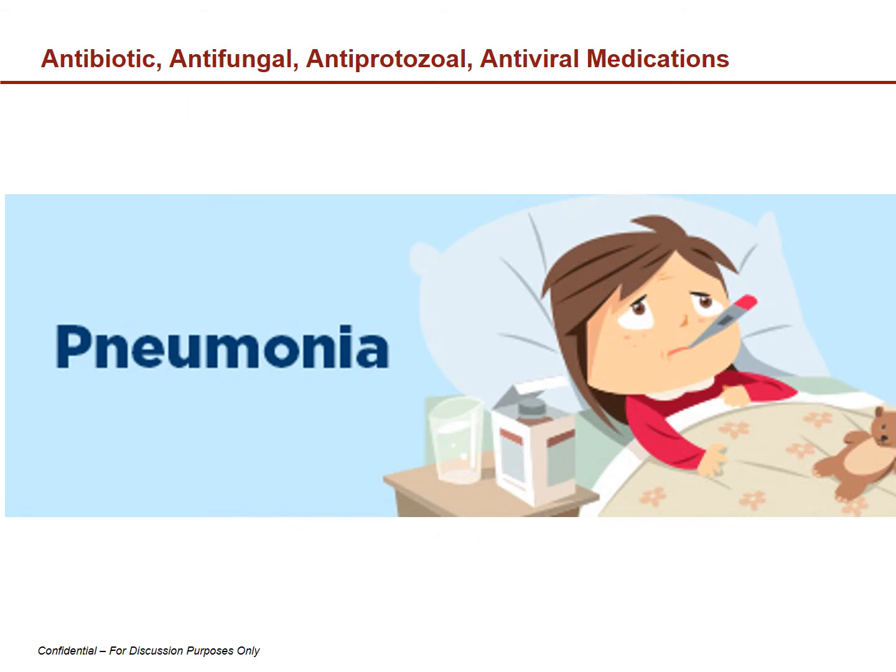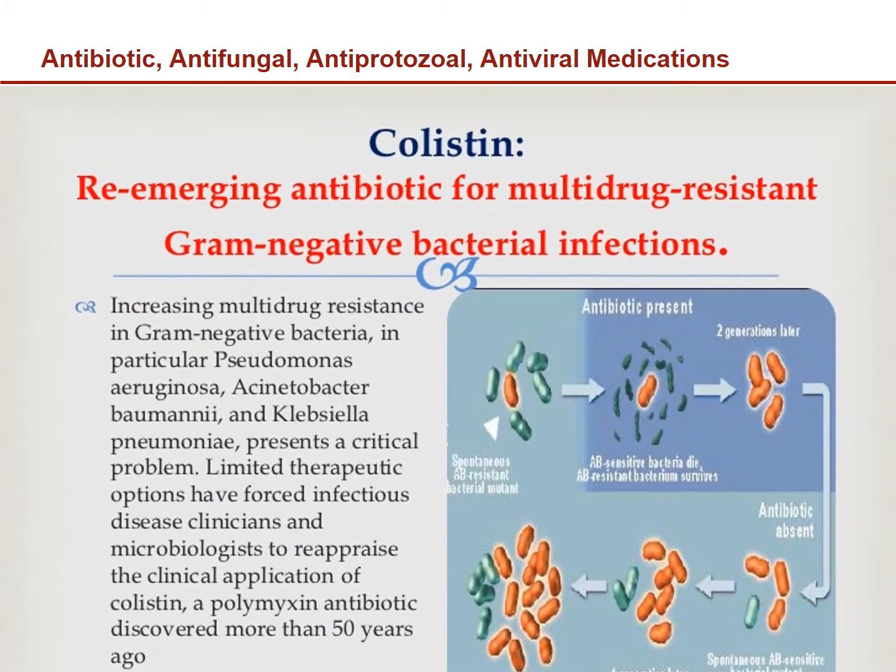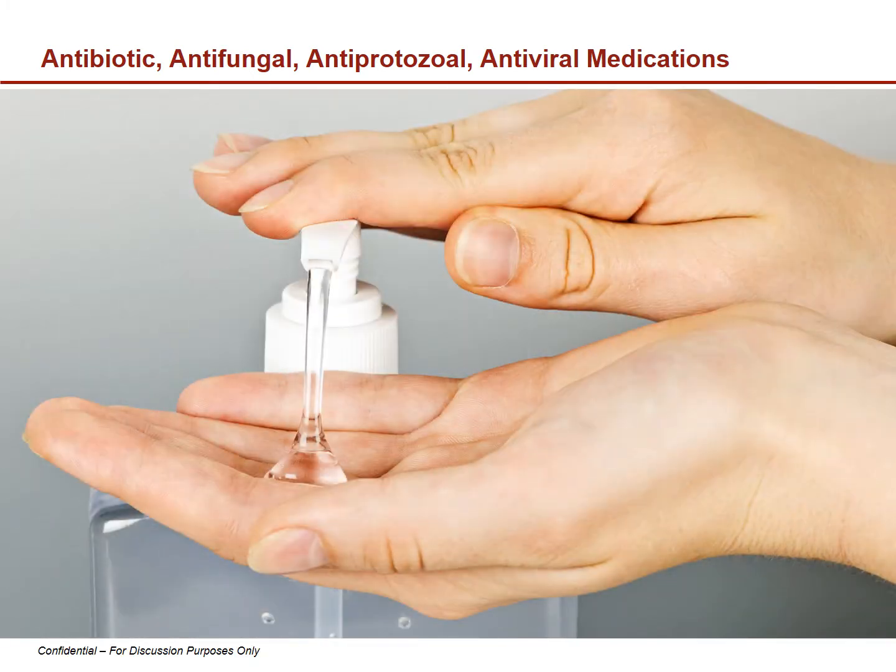Colistin is an antibiotic that can be nebulized to treat hospital and ventilator-acquired pneumonia, especially those caused by multi-drug resistant gram-negative bacteria that has not responded to treatment with systemic antibiotics. Nebulized colistin may also be used to treat infection with Pseudomonas aeruginosa, Klebsiella pneumoniae, and Acinetobacter baumannii. Colistin has a short shelf life, so the nebulizer solution is prepared by the respiratory care practitioner immediately before administration.